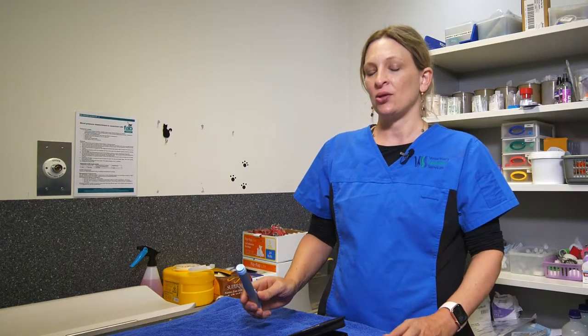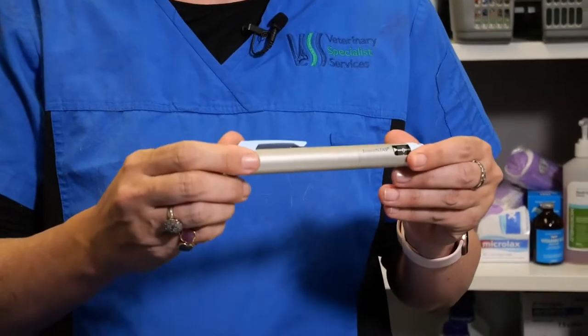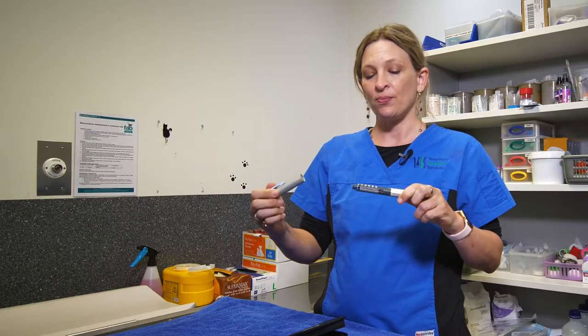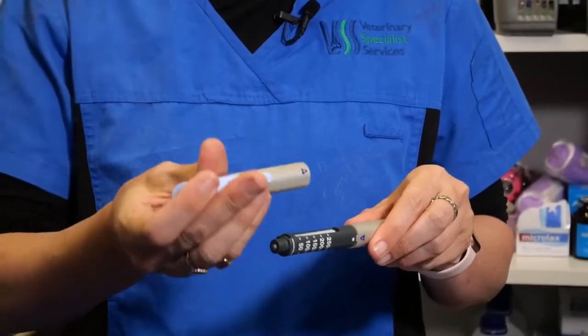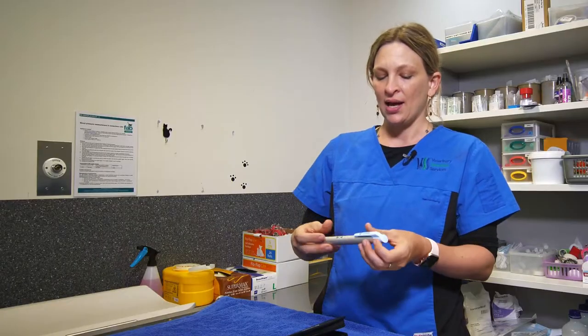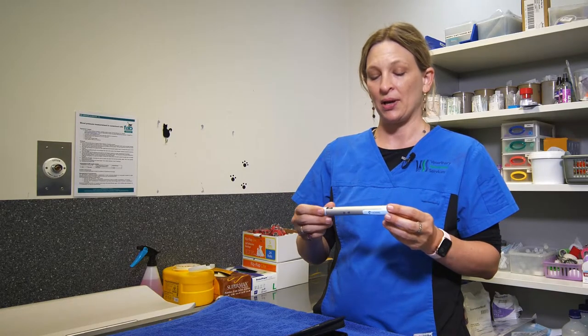There are three main pens that we use. This is the Sanofi Junior Star insulin pen for glargine, and it's a reusable pen, so you can purchase little cartridges of glargine that are then placed into the pen. We'll demonstrate how to do that, and you keep this pen for as long as your cat is diabetic.